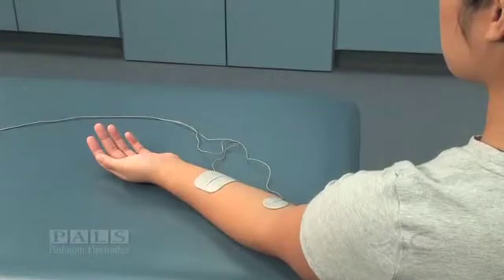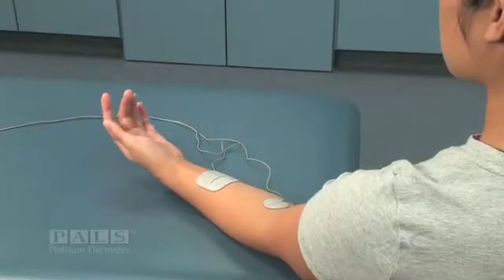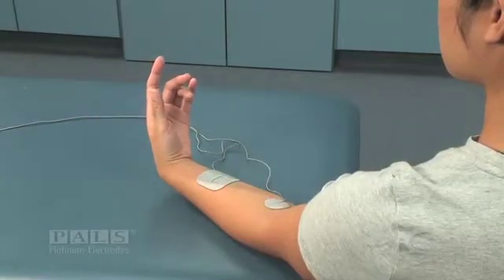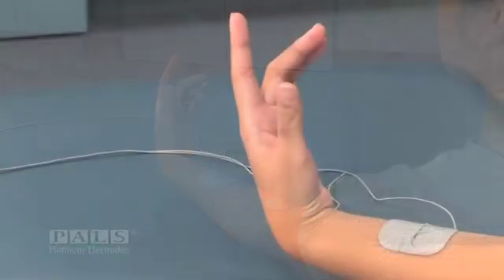This is a demonstration of electrode placement resulting in radial or ulnar deviation. This placement is the good response that provides balanced wrist flexion.